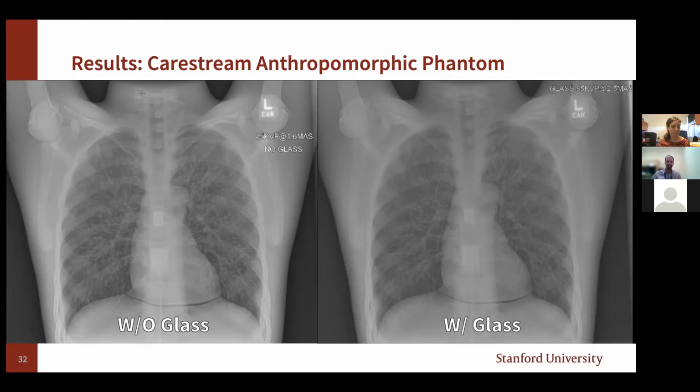But in therapy, with a lot of this image guidance, you now see patients that receive maybe 30 CT scans or onboard imaging systems, and dose calculations are so carefully estimated, but I don't think imaging is part of that equation. That's right. I've seen studies that show that over the course of radiotherapy, these patients are receiving many hundreds of millisieverts of imaging dose that doesn't get accounted for in their plan.